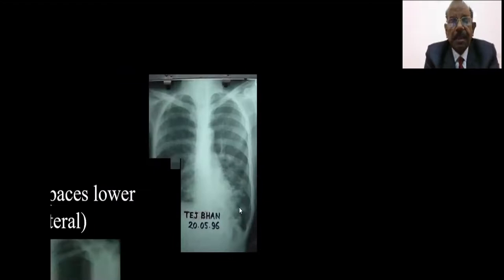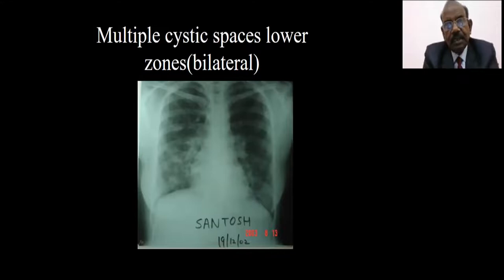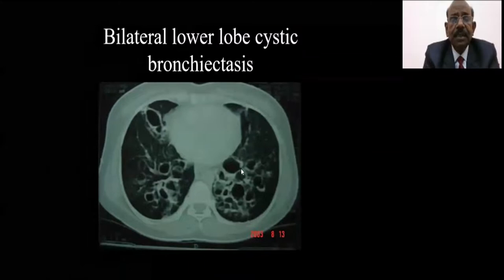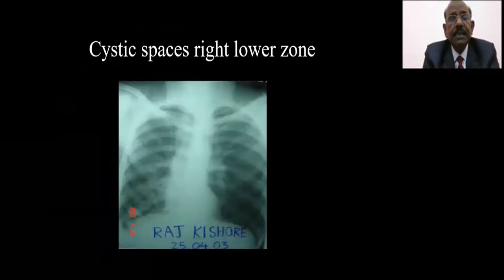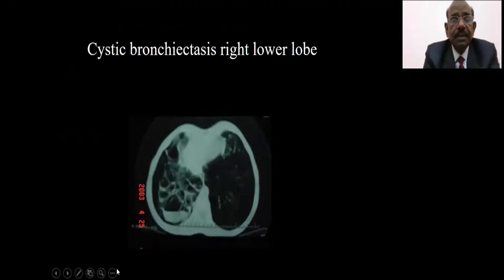You can find disease localized at the bases. The most common site of bronchiectasis is the lower lobes, followed by the middle lobe or lingula, and the least common is the upper lobes. That is why most of the findings are in the lower lobes. You can see this cystic type of bronchiectasis on CT thorax for the same patient, with localized changes and cystic changes with fluid levels visible.